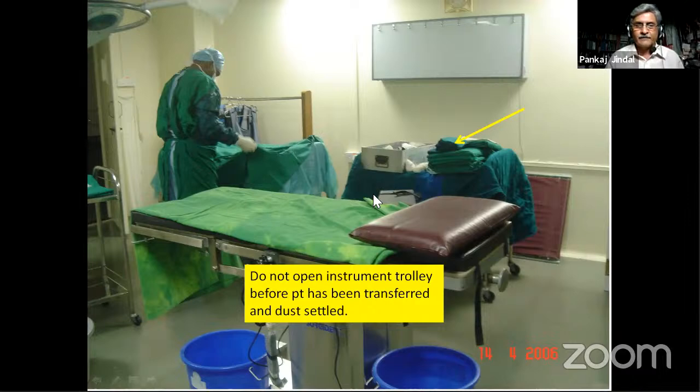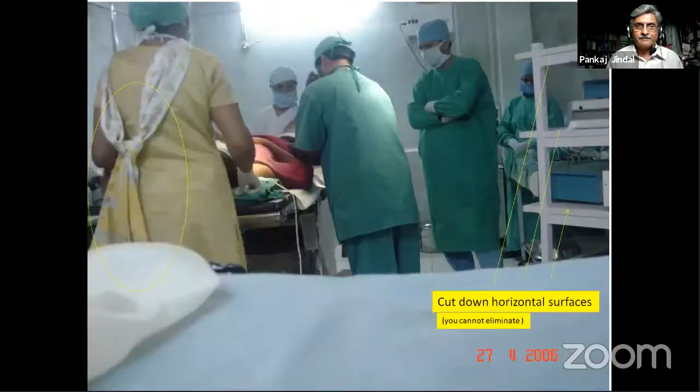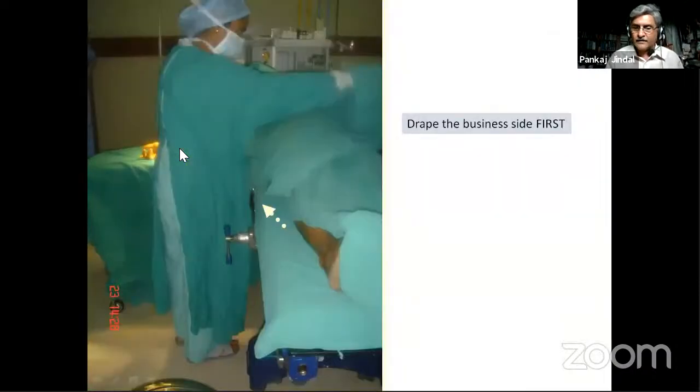Don't open up everything before the patient has been wheeled in, has been covered adequately and completely. And you see everything has been opened up and the patient is still to come in and be draped up here. This is absolutely no, because you're going to raise all the dust here. And you see he's all prepared here. The moment this lady swings here and there, she's going to swing all the dust into the room, and that's what we practically always avoid here.